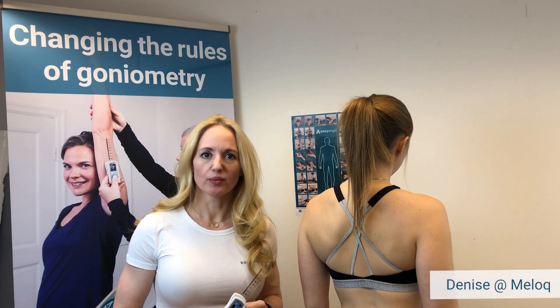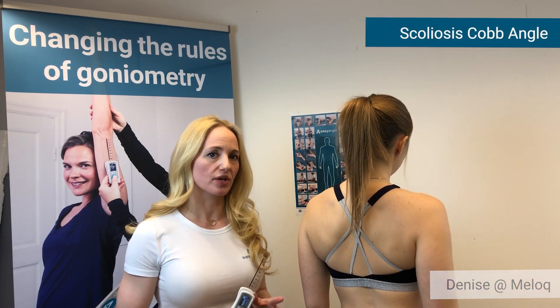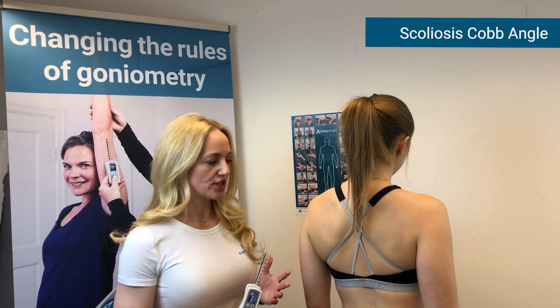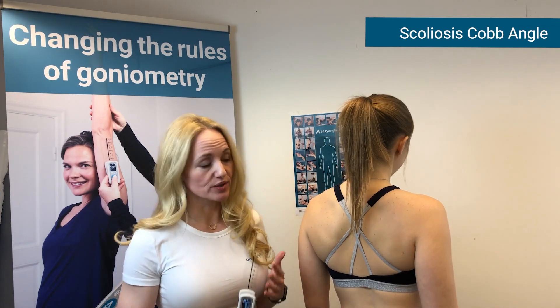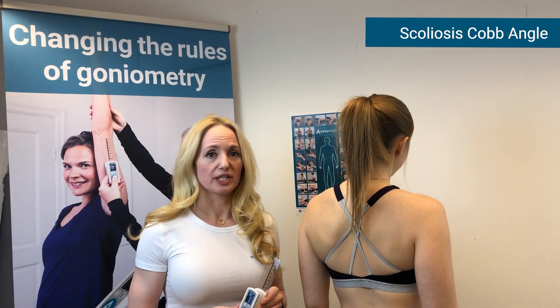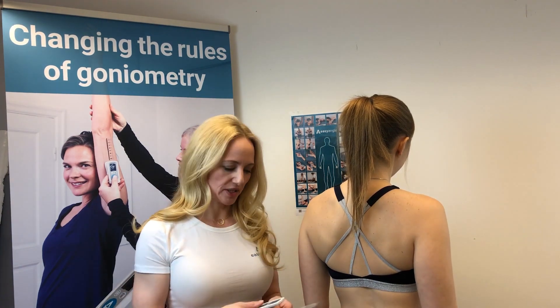In this measurement video we're going to demonstrate how to get the Cobb angle on scoliosis. Our patient doesn't have scoliosis, but we will take the measurement anyway and show you a diagram that basically shows how this measurement is taken.